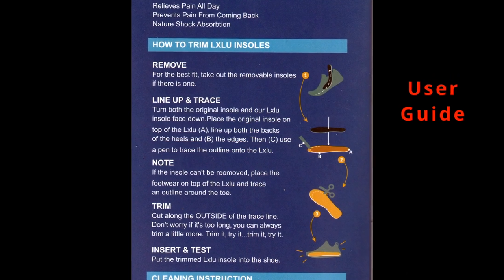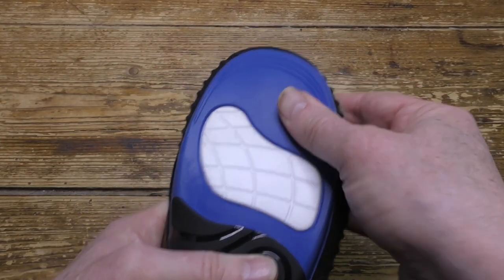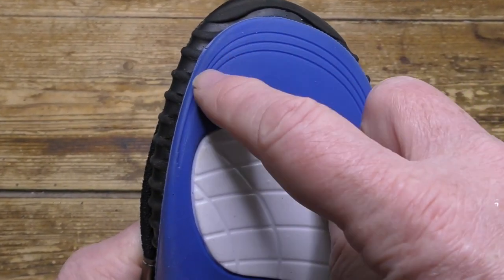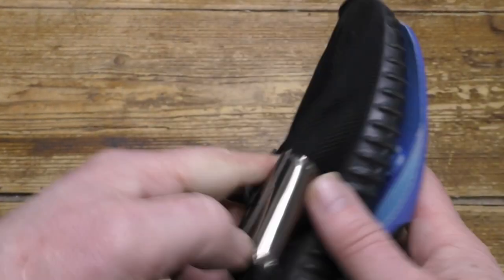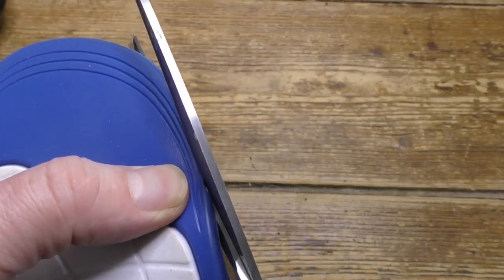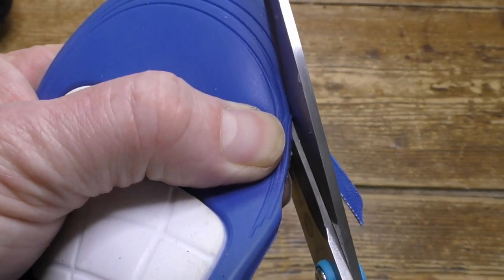Although the insoles do come in particular shoe sizes, you can trim them down further to fit your particular shoes. Line them up first and then use the guide on the insoles to get the exact size that you want. Just trim the toe area, follow the guidelines if necessary, but don't be tempted to trim around the insole part — leave that alone.